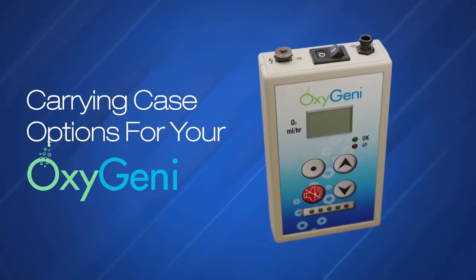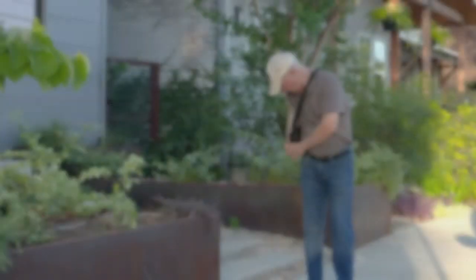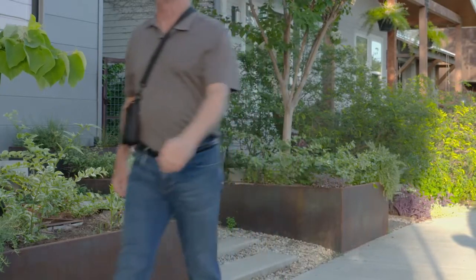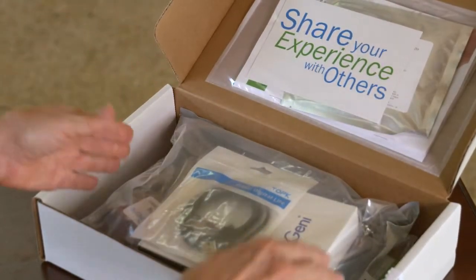This video will demonstrate the different carrying case options included with each Oxygeni. There are many different ways to carry the device while going about your normal activities. Within each kit, there are two different carrying cases offering many alternative ways to carry your Oxygeni.